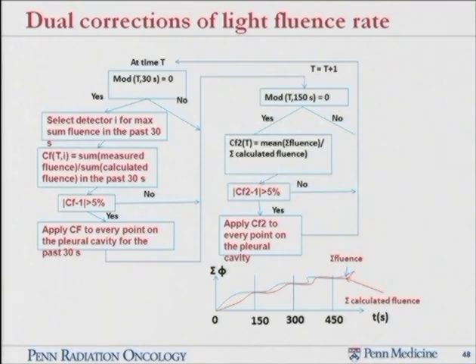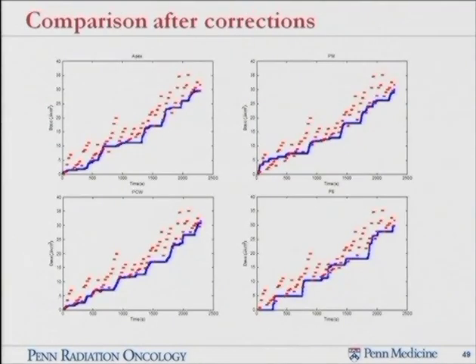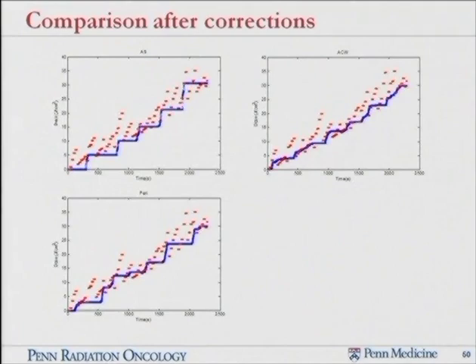the data I'm going to show you, which just uses direct light calculation, okay? So you can see, at least in this case, they're jumping around a lot, but in the end, at all sites, the calculation, which is these dots, agrees with the measurement. And that gives us some confidence in using this correction method. One thing that's a little tricky is that the correction has to be the same correction. You have to correct all the sites, 7 sites, simultaneously. So there is some truth in the model itself to match the data between the calculation and measurement.